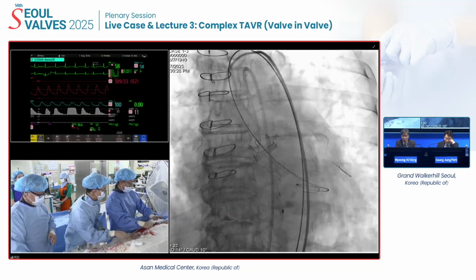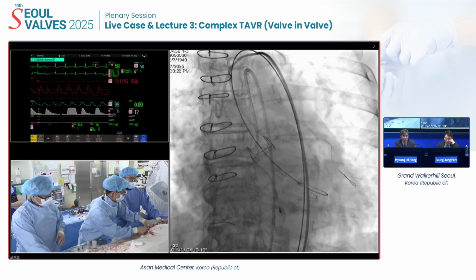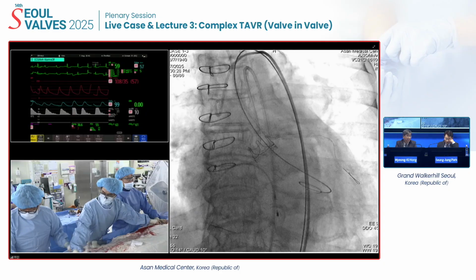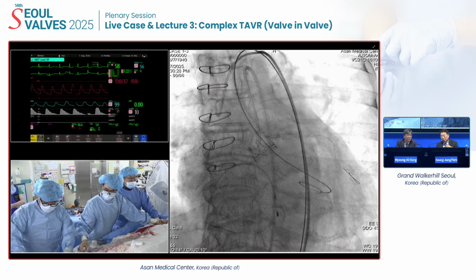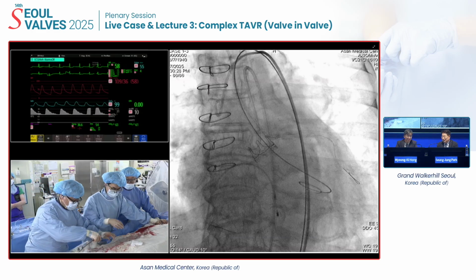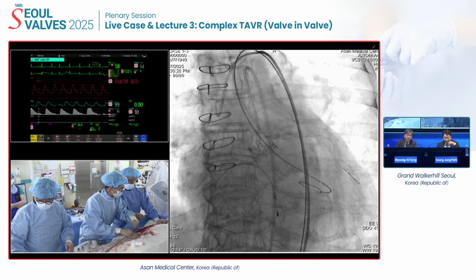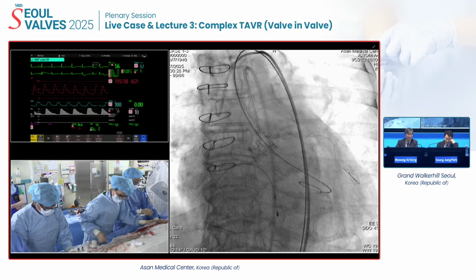Okay, I agree with not trying the valve fracture. Absolutely. The patient's age is 85. Yes. Although some hemodynamic pressure gradient remained, that's okay. Yeah, this patient has an AS component as a major portion, Vmax more than 5.3, and mean pressure gradient more than 60. Okay.